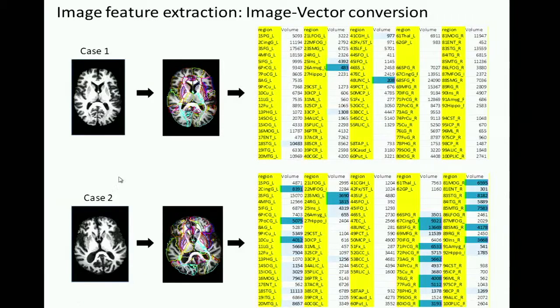And this is another case. If we have an age-matched control, average plus or minus standard deviation, we can do something very similar to a blood test. These numbers in blue are outside the normal range, more than 3 standard deviations away.